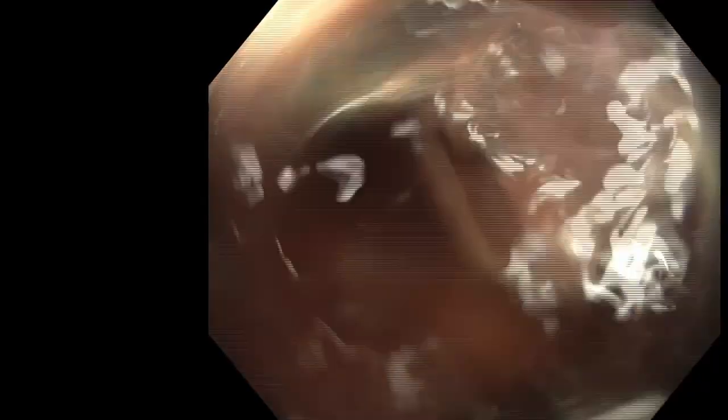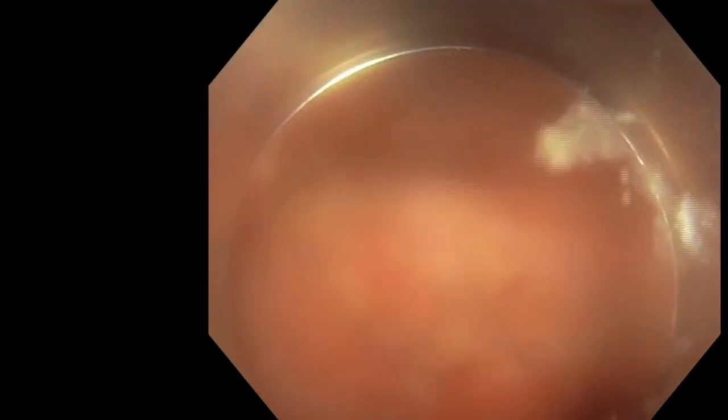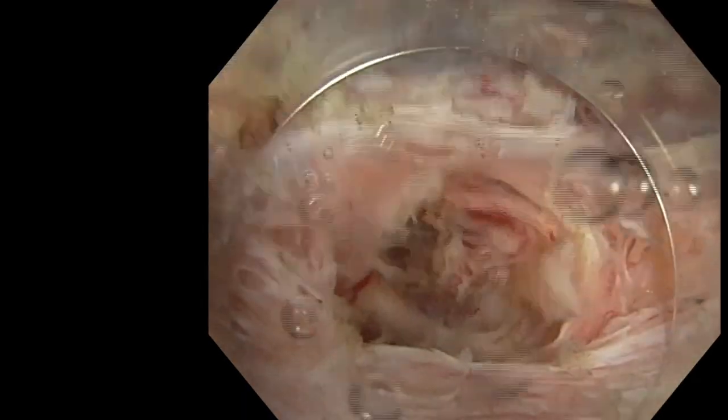So the water was a little blurred by the blood, and therefore the resection is almost achieved. Only small fibers remain that came off mechanically, and you will see that the bottom is not perforated.